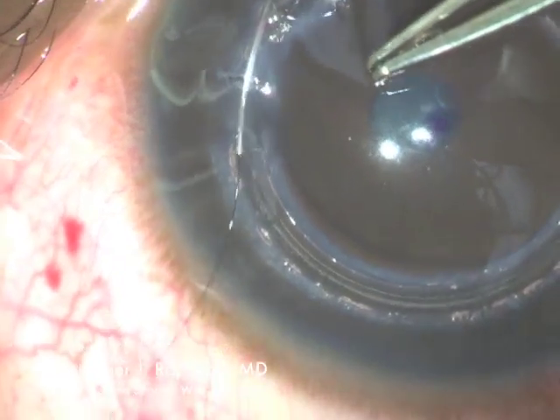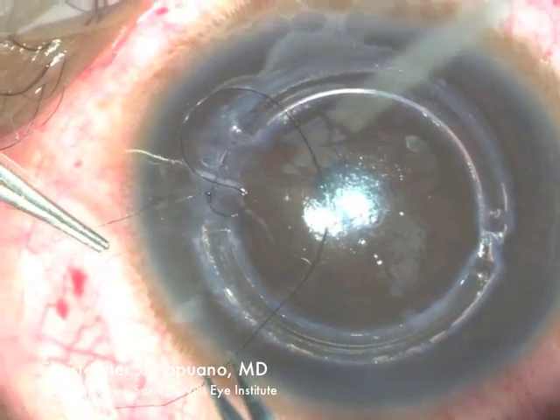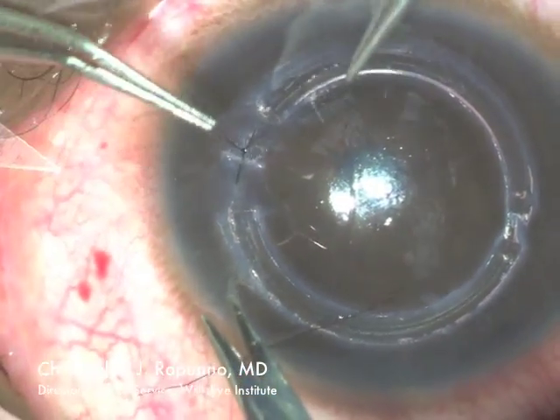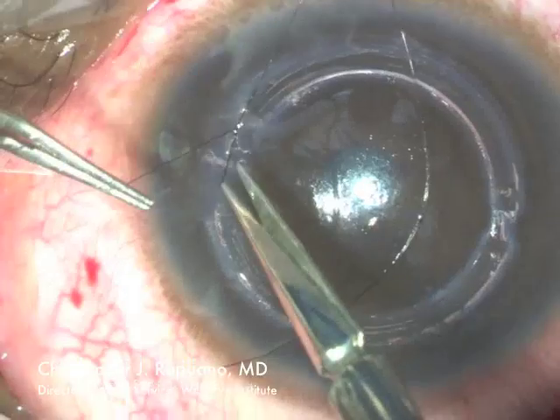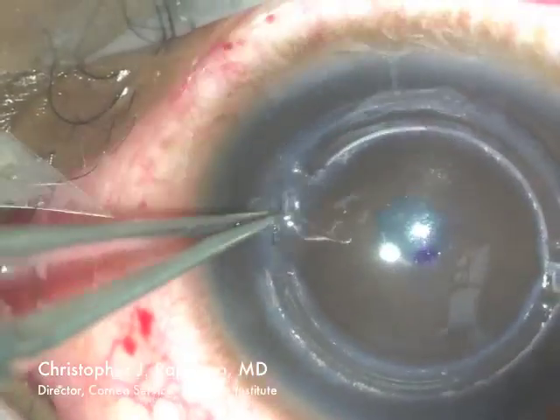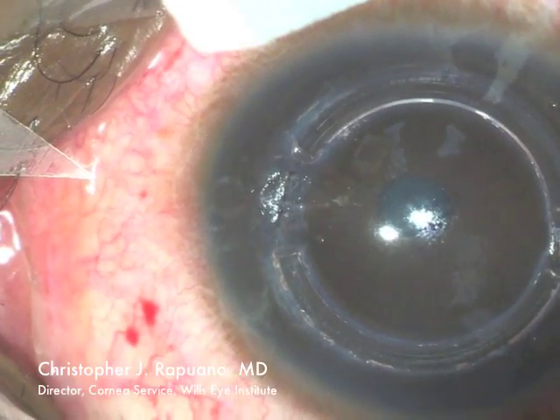It is tied and then the knot is buried. I attempt to tie these knots fairly tightly so that the wound does not open up after surgery. These sutures are then usually removed about six weeks post-op.